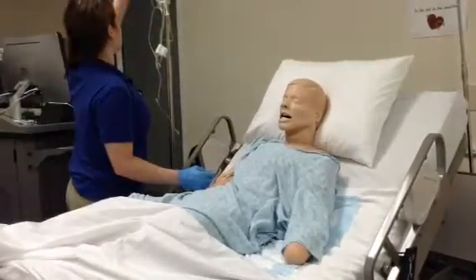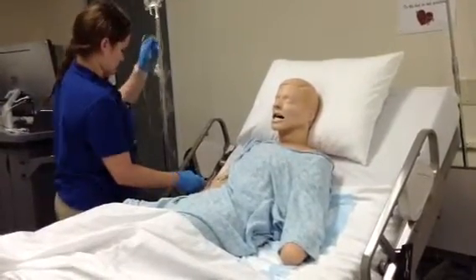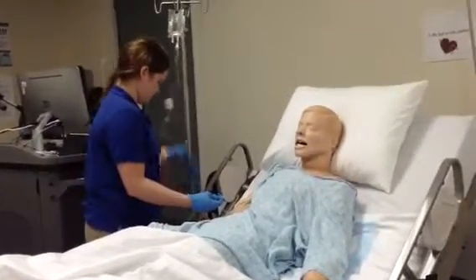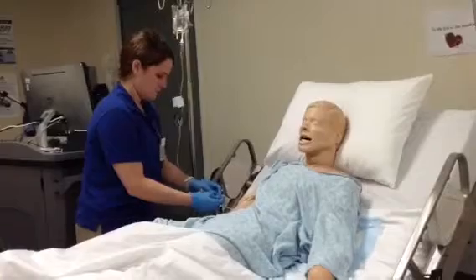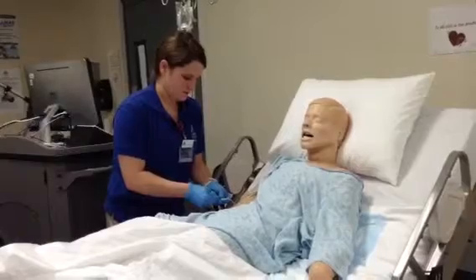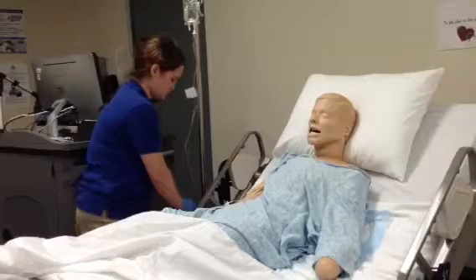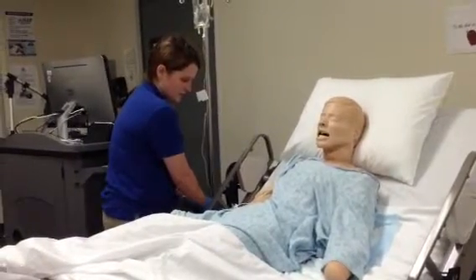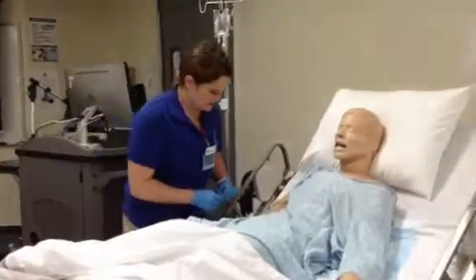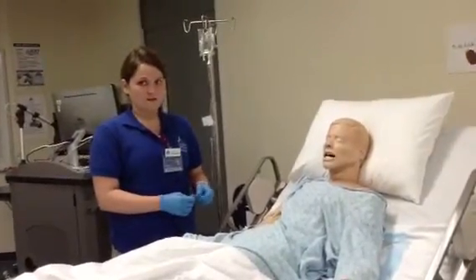And I'm going to use meds. Connect it. Make sure it's not clamped. Make sure it's running. And I'm going to check the site again and make sure I don't see any phlebitis or infiltration.